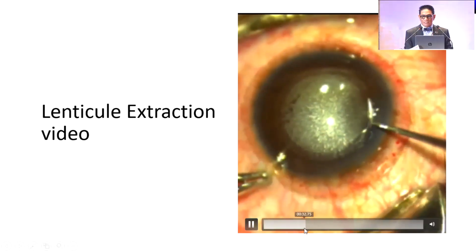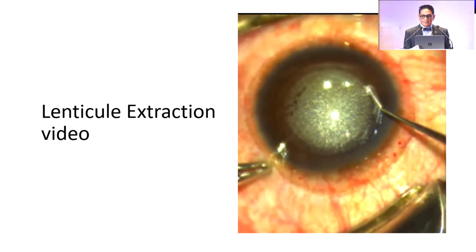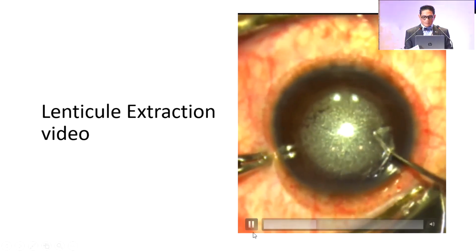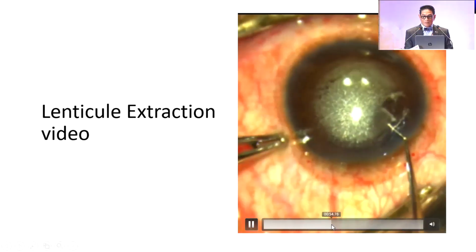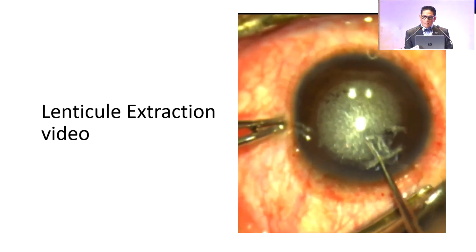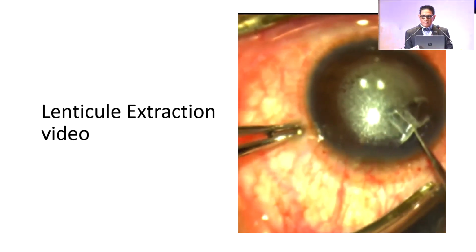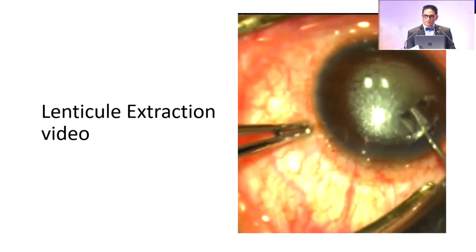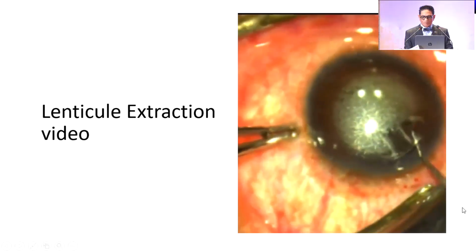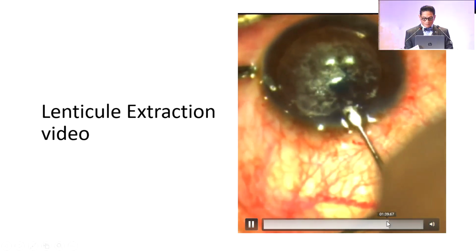And then we just insert the cannula there in the posterior, and I just check the anterior. Okay, I think we should proceed.